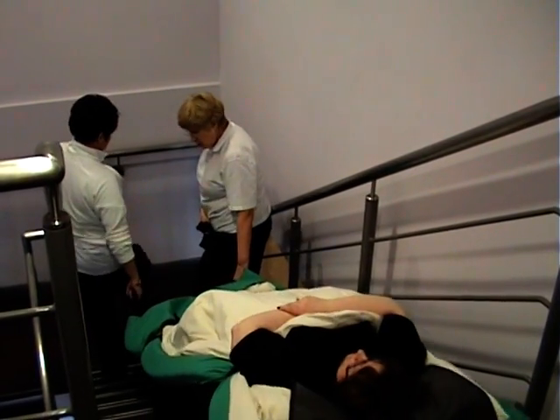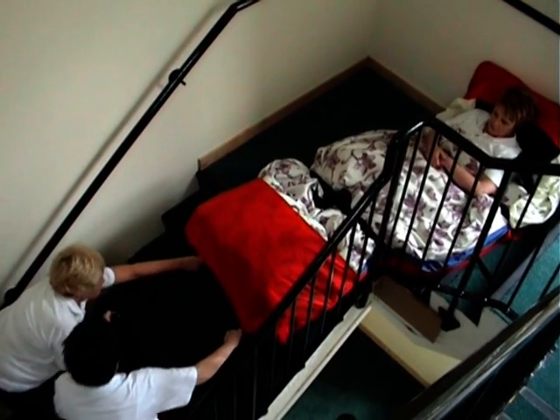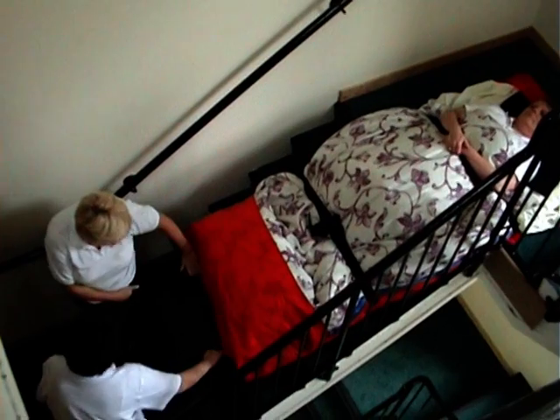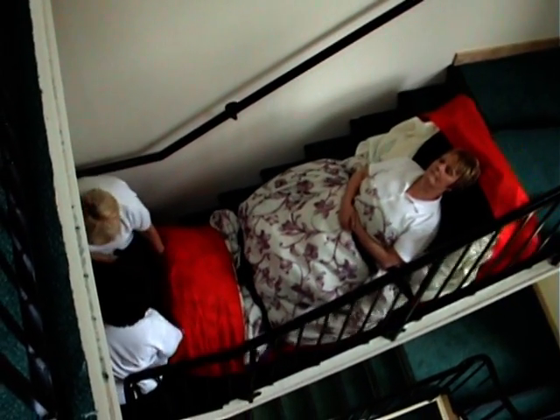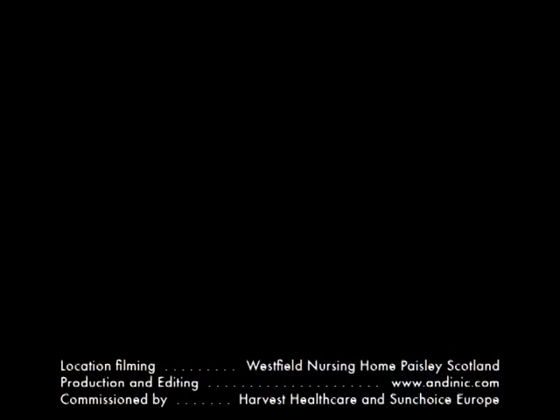All of the evacuation devices for beds work on the same principle. However, if using the red parachute underlays for airflow mattresses, take into consideration that the airflow will only maintain pressure for 7 to 9 minutes. A vertical evacuation must always be carried out for people nursed above the ground floor when using this product. Always remember to connect the airflow tubes from the box mechanism together.